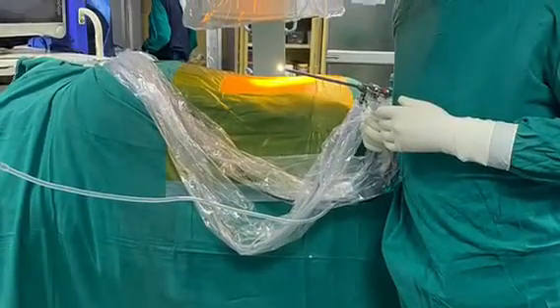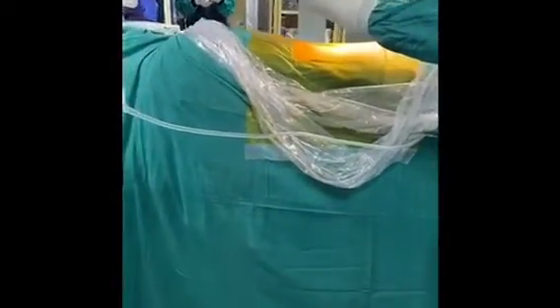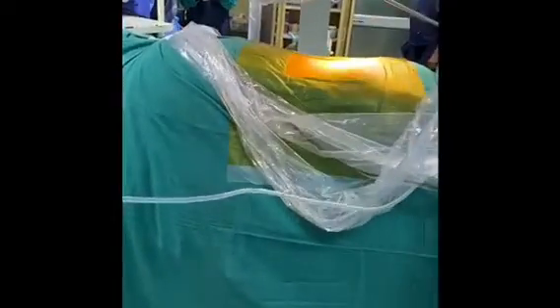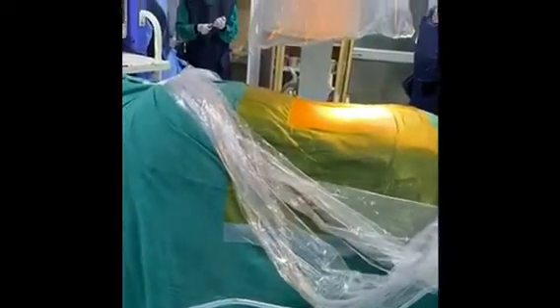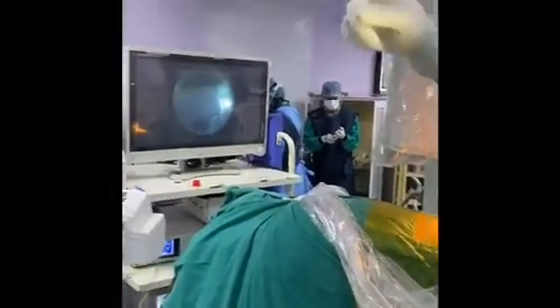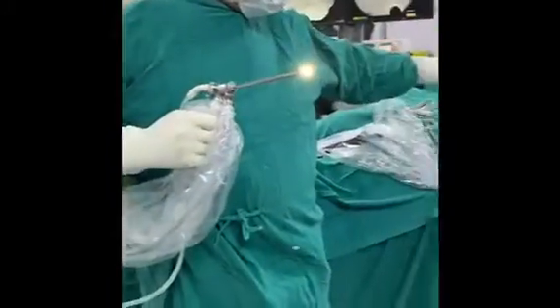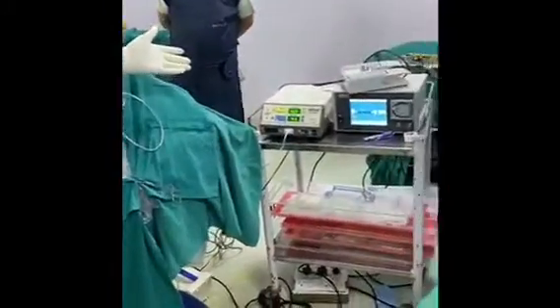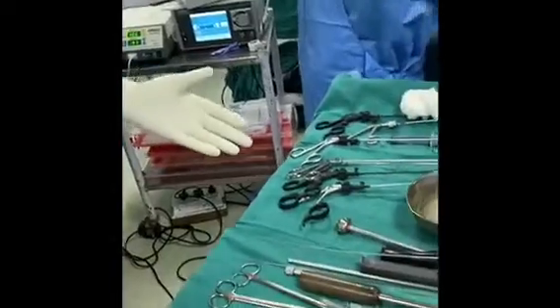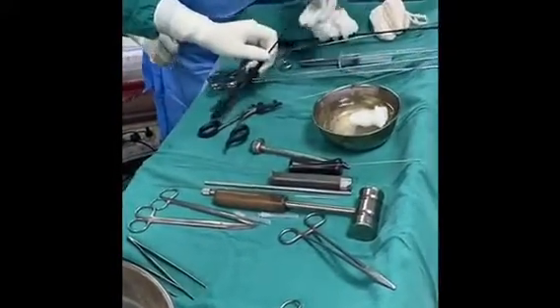We have decided to do the most minimally invasive procedure in the world, which is the endoscopic discectomy. We are the pioneers in this and started it way back in the year 2000, and have done thousands of cases so far. The procedure is done under local anesthesia, so the complications of general anesthesia are also prevented. We do it under C-arm control, using a coterie, a pump, and various other instruments.